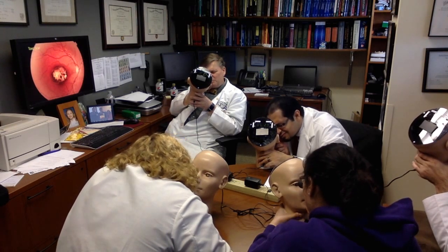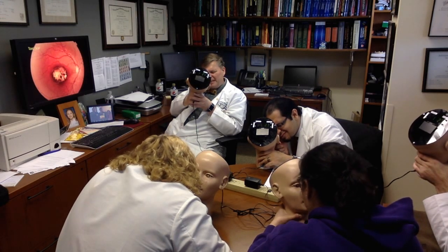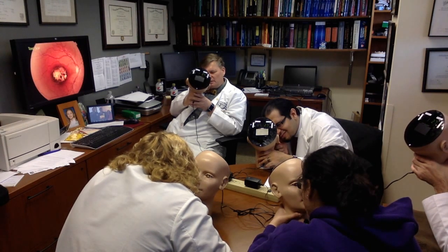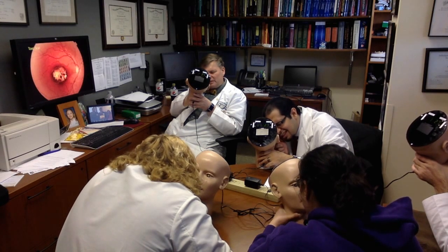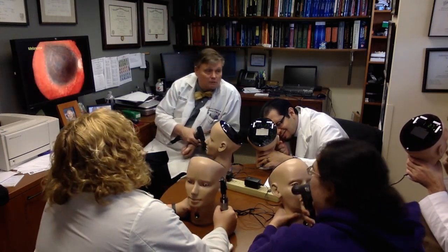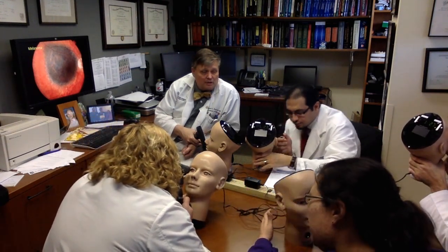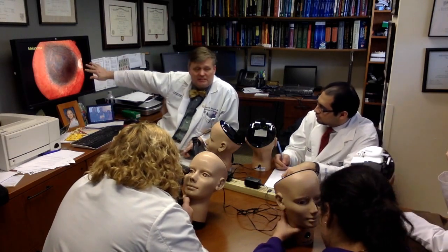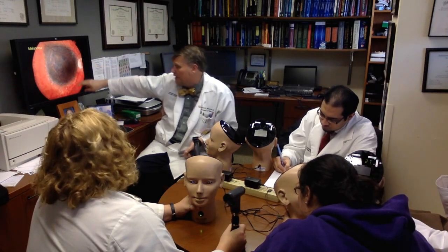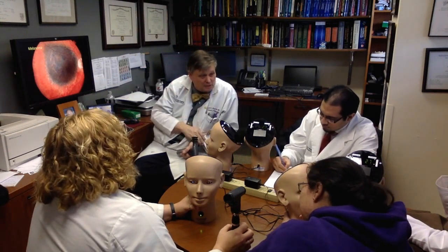Do you agree there's some pigment around the outside, especially lower? And can you convince yourself it's really not that flat? It may be slightly elevated off the disc, off the retina. Can you appreciate that maybe it's elevated? That's harder. Okay, so this is a melanoma. Now we're not going to make this diagnosis. We're going to call the ophthalmologist. But if you see this pigmented thing that looks gray, blue, maybe dark, especially if it looks like it's raised off the retina, that's what we worry about as a melanoma.